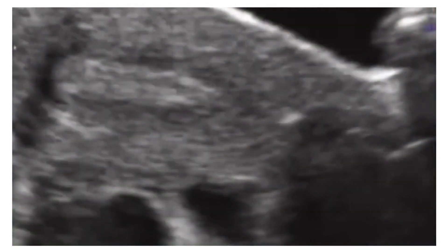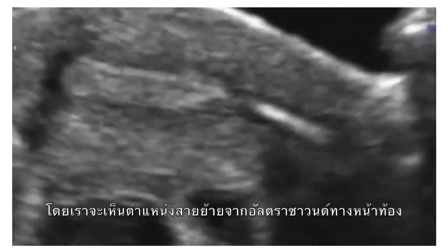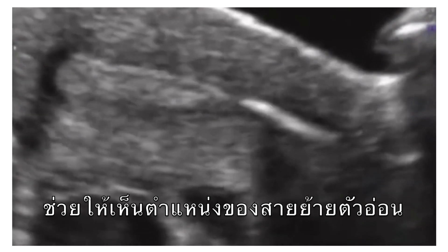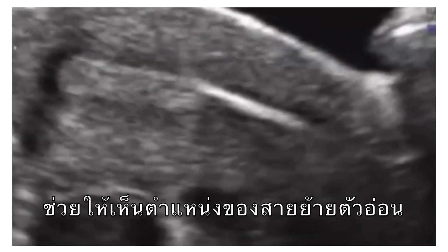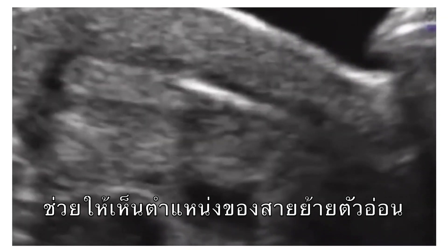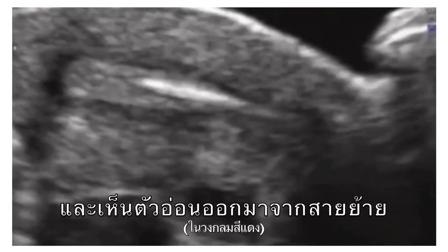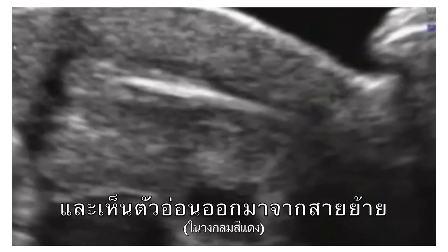The procedure will be guided using an external ultrasound through the abdomen, and you will be able to see the catheter inserted, positioned in place, and then the embryo injected.